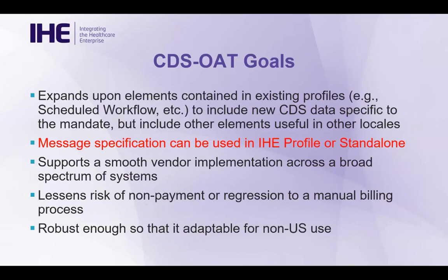In the message specification defined in CDSOAT, there's a paragraph that explicitly states that the message specification can be used within this CDSOAT profile or standalone. This is kind of unique for CDSOAT, and it has been updated in the recent text.